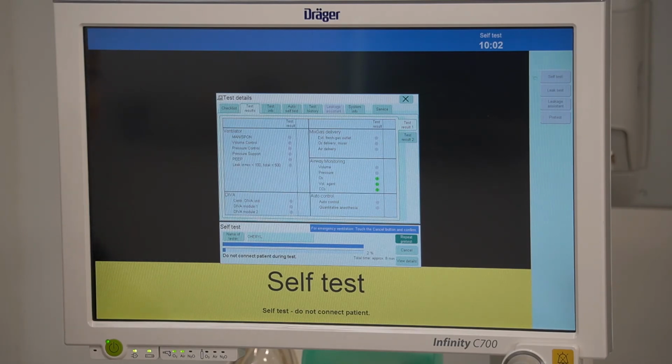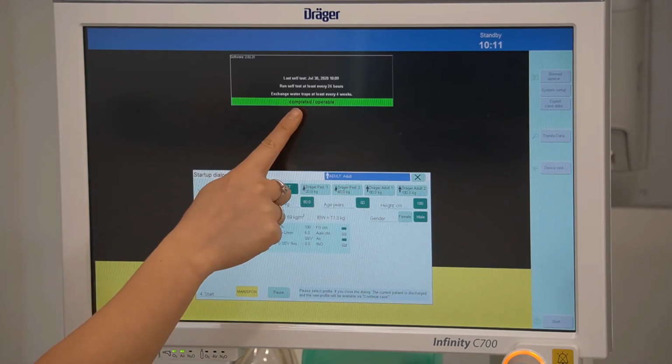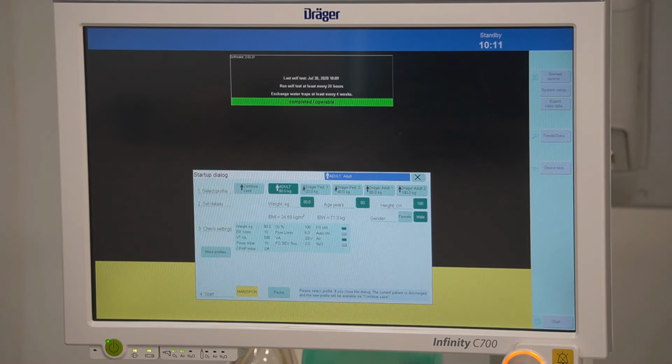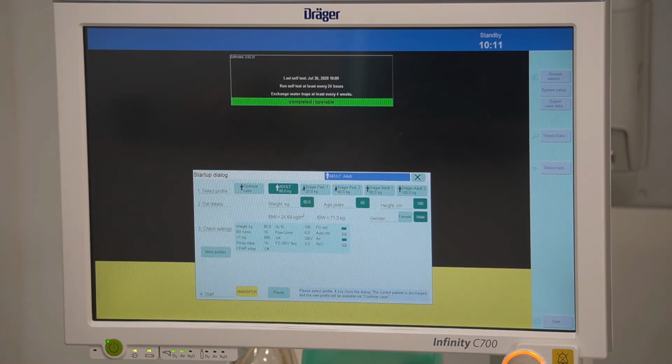Visually inspect your water trap to ensure there is no accumulation of fluid. To remove the water trap, squeeze the clips and pull out. If you notice fluid accumulation in the water trap, a slip syringe can be placed into the black port and removed. If the water trap becomes blocked for any reason, there will be discoloration of the top ports. The water trap should be exchanged every 28 days. To insert the water trap, squeeze the clips and push in until you hear a click.